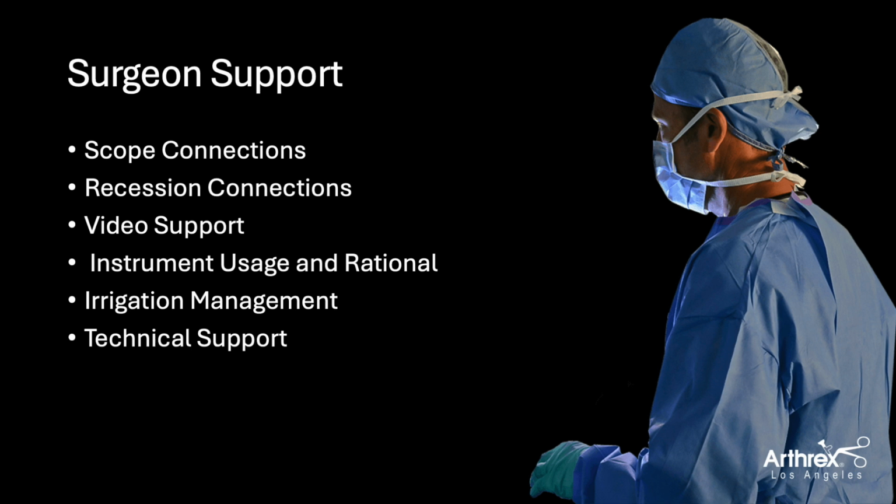Understanding also when it comes to clearing the field, if it's dealing with certain irrigation, that every 30 minutes or so a 3-liter bag is going to go empty and you're going to get stagnant water, and you can't really see the picture. I think it's important to really help support the surgeon in that aspect, and we'll get into the technical module at another point.